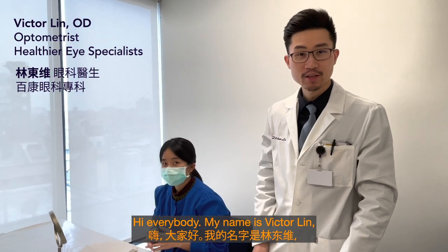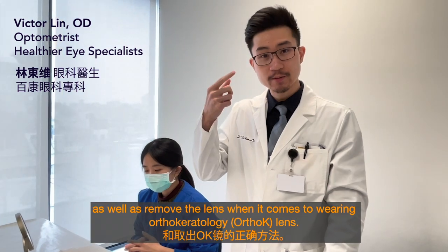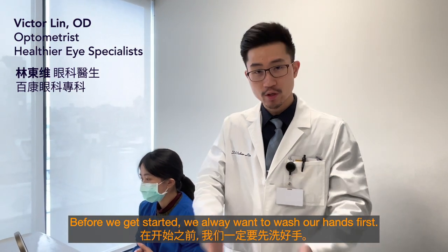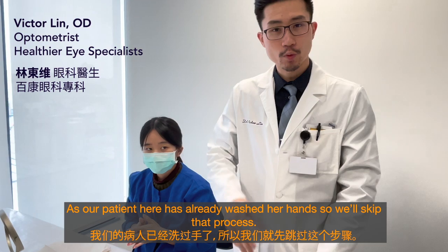Hi everybody, my name is Victor Lin. I'm here today to introduce you to how to insert as well as remove orthokeratology lenses. Before we get started, we always want to wash our hands first. Our patient here has already washed her hands, so we will skip that process.